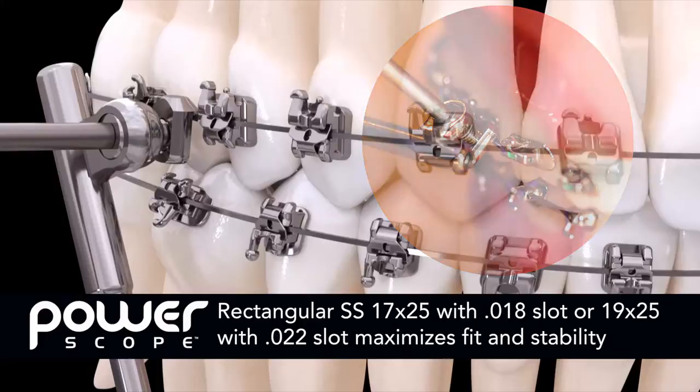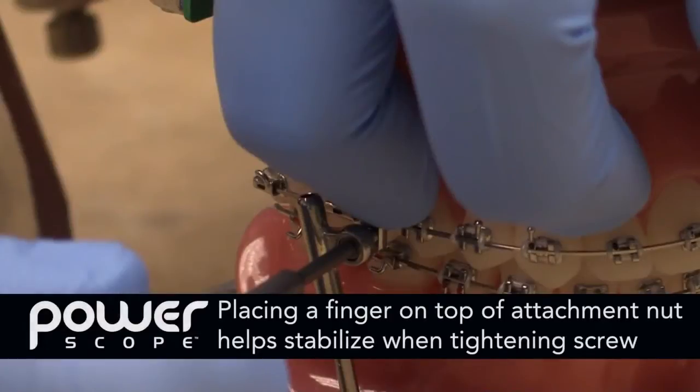A rectangular stainless steel 17 by 25 with an 018 slot, or a 1925 with an 022 slot cross section, will provide maximum fit and stability. Placing a finger on the top portion of the nut attachment will also help in stabilizing the nut mechanism when tightening the screw.